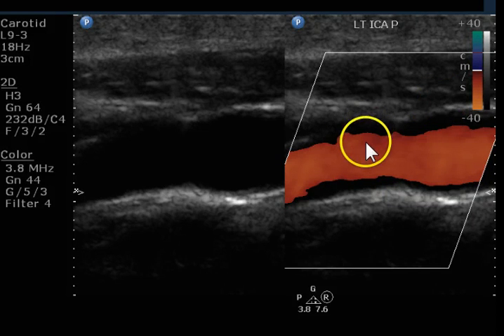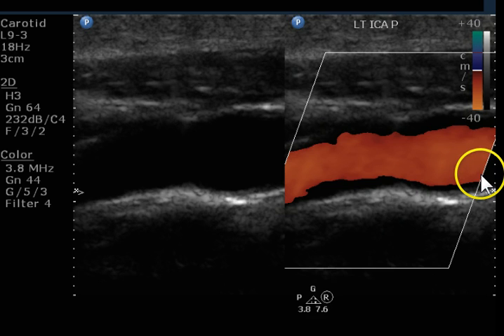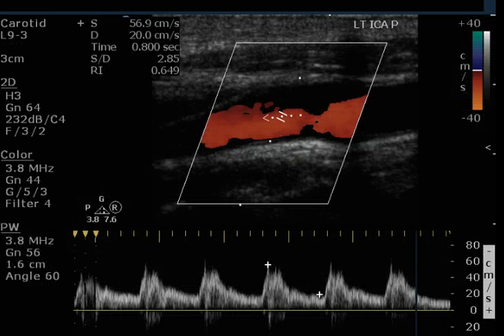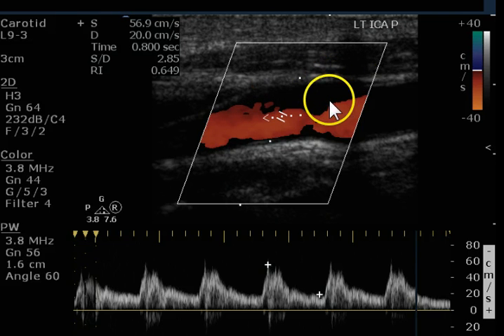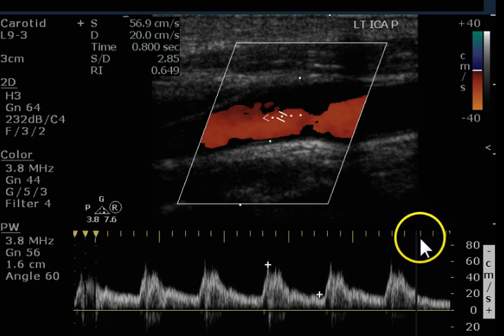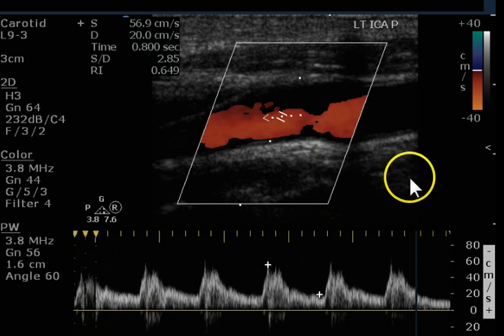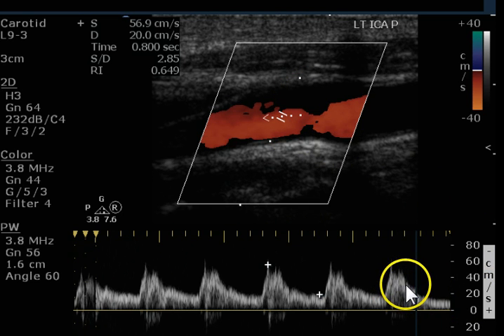Proximal ICA looks good, though I question the timing of the freeze here. I doubt there's plaque in this configuration. The timing of updating is even worse — this all looks like disease, but it's just that they froze during late systole or early diastole. Here's where they update it, and you can see it's at a low flow portion of the cycle — that's why there's all this black here. You always want to attempt to freeze during systole.